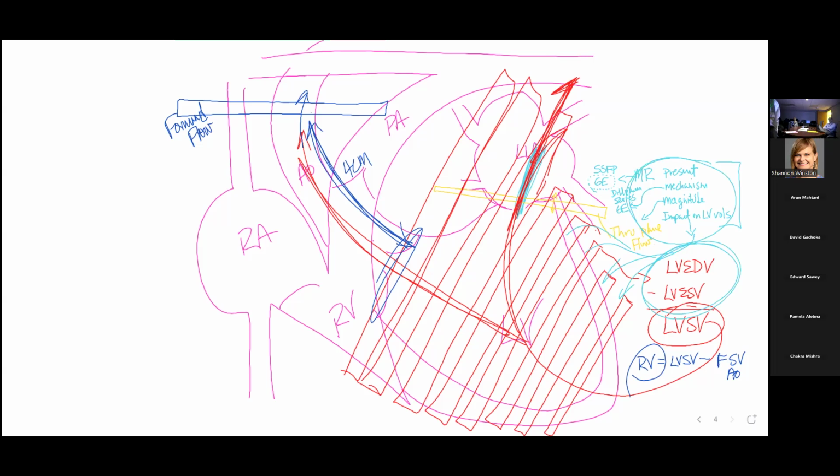You can also do the same principle for aortic regurgitation. You can measure LV stroke volume total, and you can measure forward, and you can subtract, and you can get the regurgitant volume this way. When I do that, I also will put a slice plane here, just like we did with the mitral valve, because I like to do it both ways and just compare them. So it's a really nice way to measure these regurgitant volumes.